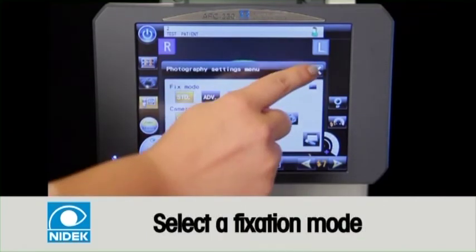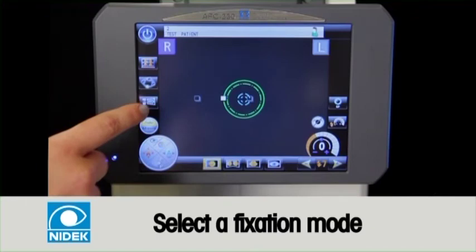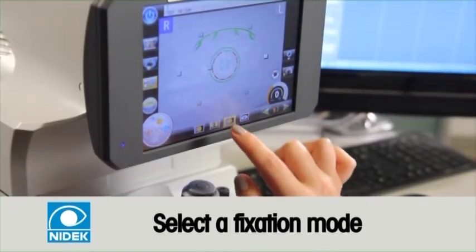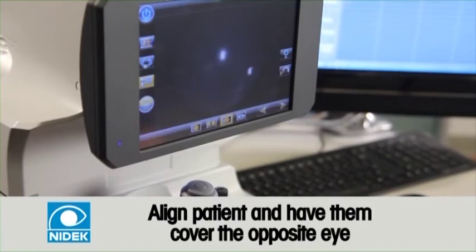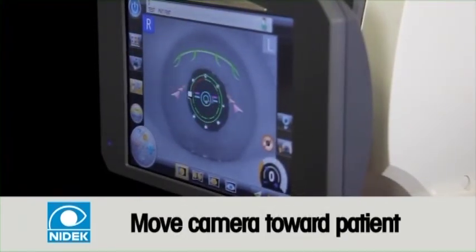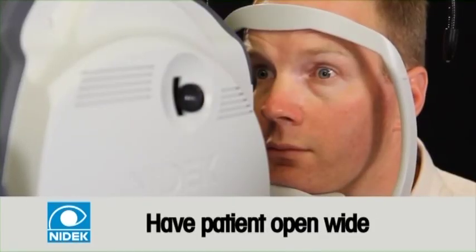The operator can use one of the preset fixation templates or the optional external fixation. The operator can use all 7 points or manually tap on desired points. Align patient and have them cover their opposite eye. Move the camera towards the patient and instruct them to look directly at the flashing target. Have the patient open wide while not blinking or moving.